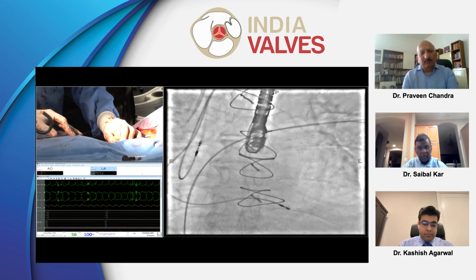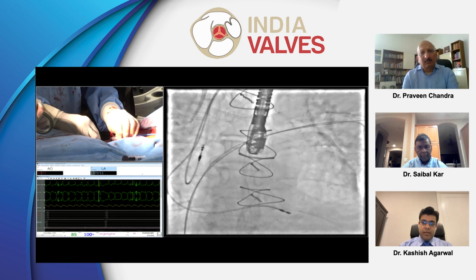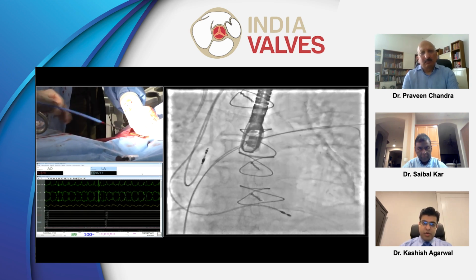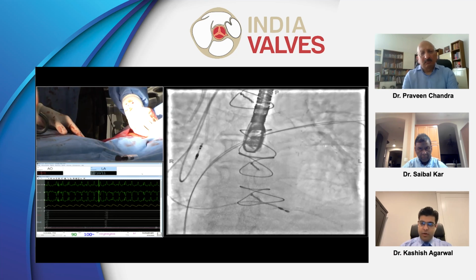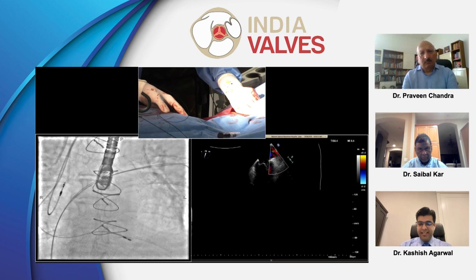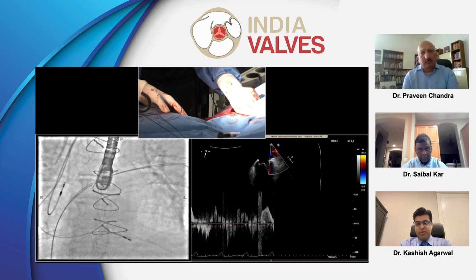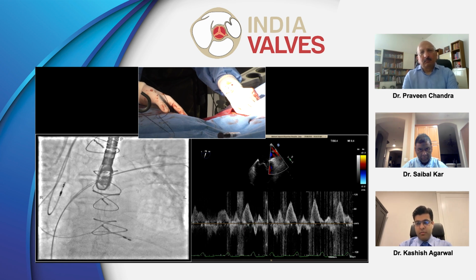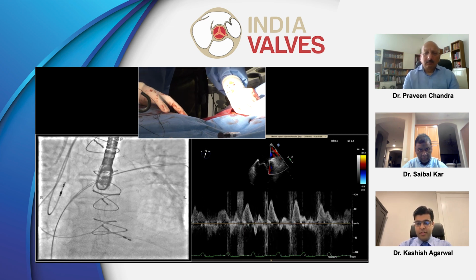Let's put a 4 French pigtail, please. It's very low clinically, but when you look at national data sets or even trials, they still report 1 to 1.5%, which I don't know why we see. It's probably just that every time you puncture, even in AFib ablations, they have shown there is a stroke rate. So every time we enter the LA, there is a small risk.